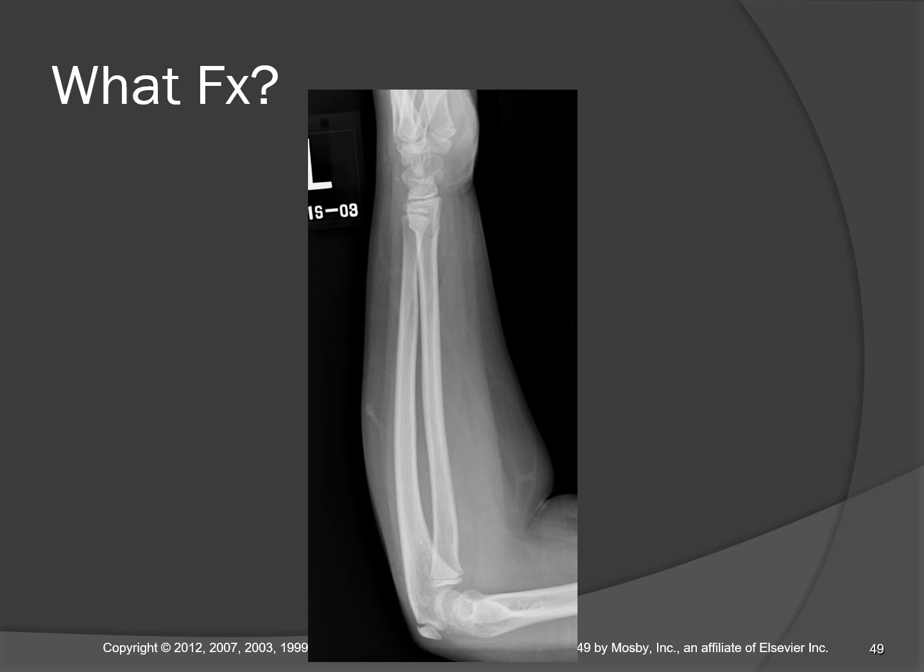Kind of looks like a pimple or a blemish. That's actually the bony cortex bulged out because the radius has collapsed on itself right there. And so it's kind of like a crushing injury to the end of the radius and a buckling of the cortical wall of the distal radius.